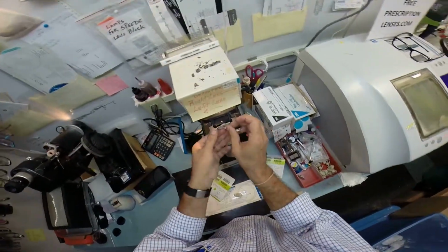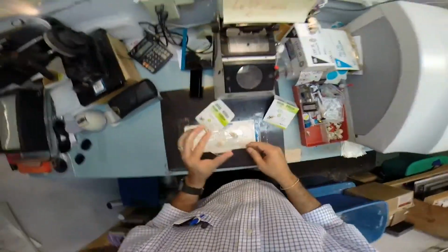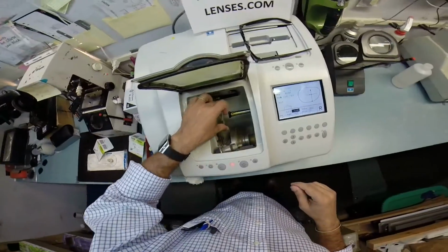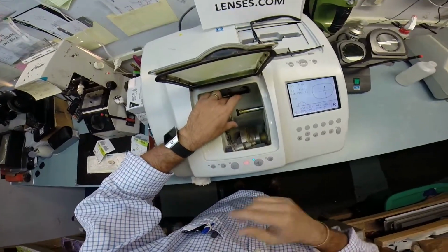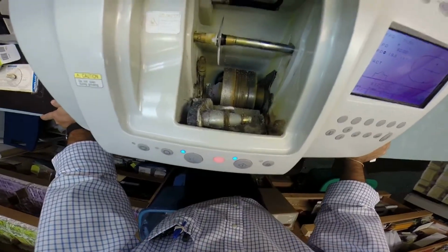Okay, so I'm going to put another block on there, pull away the double-sided tape, get everything lined up perfectly, and let's begin. Since there is no left or right, you're the same in both eyes, I will use this lens. I'm going to put it into the chuck, or as I like to call it, the Charles, because I don't know this machine well enough to call it Chuck.